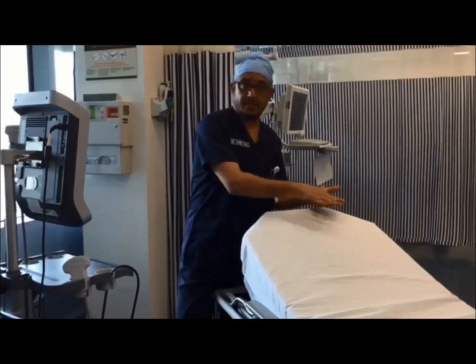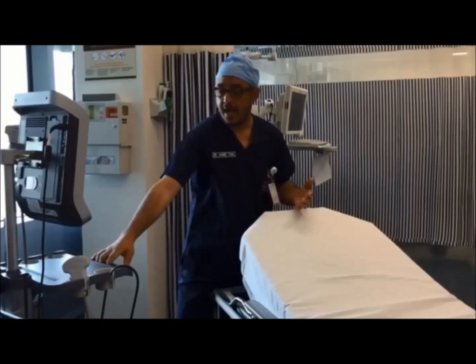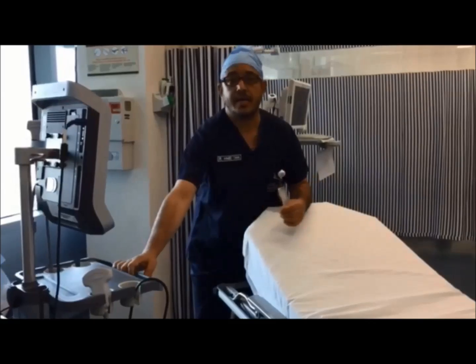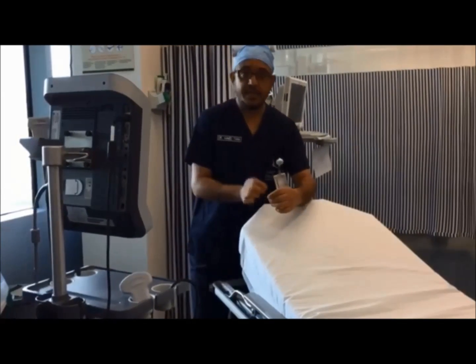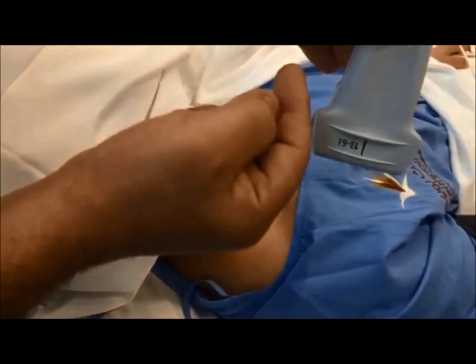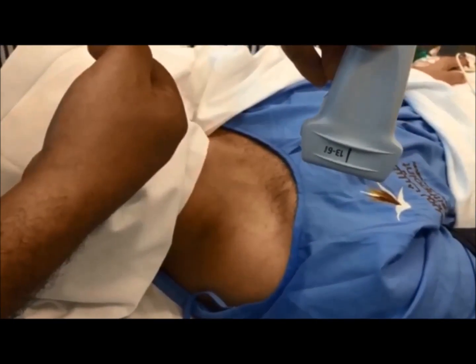Then I tilt the patient's head in this direction and place the ultrasound machine just in front of me, so I can simply adjust the needle while looking at the machine at the same time. When the probe is placed, the mark is always oriented to the left.